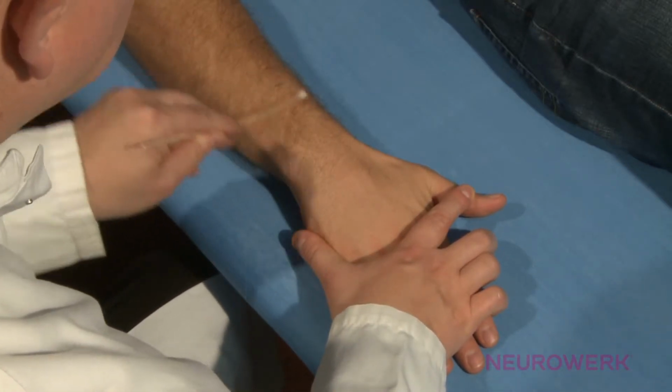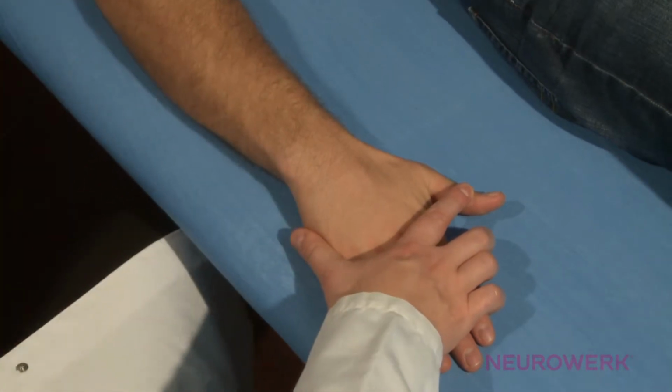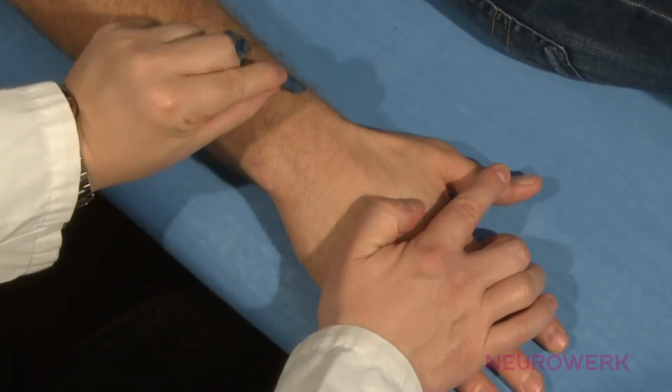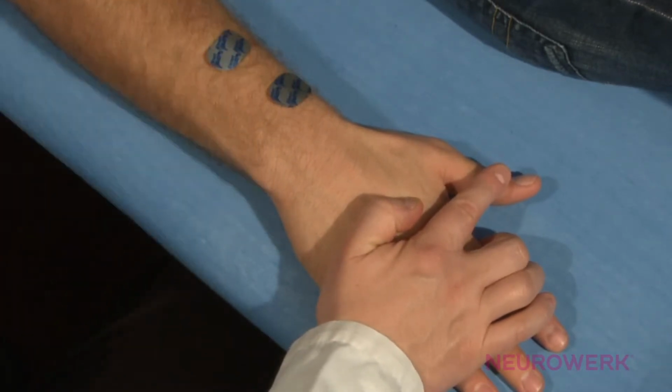The exact electrode position is determined by the maximal splaying out of the thumb. The indifferent or reference electrode is attached to the tendon of the muscle. The ground electrode is mounted to the right, proximally from the recording electrodes.